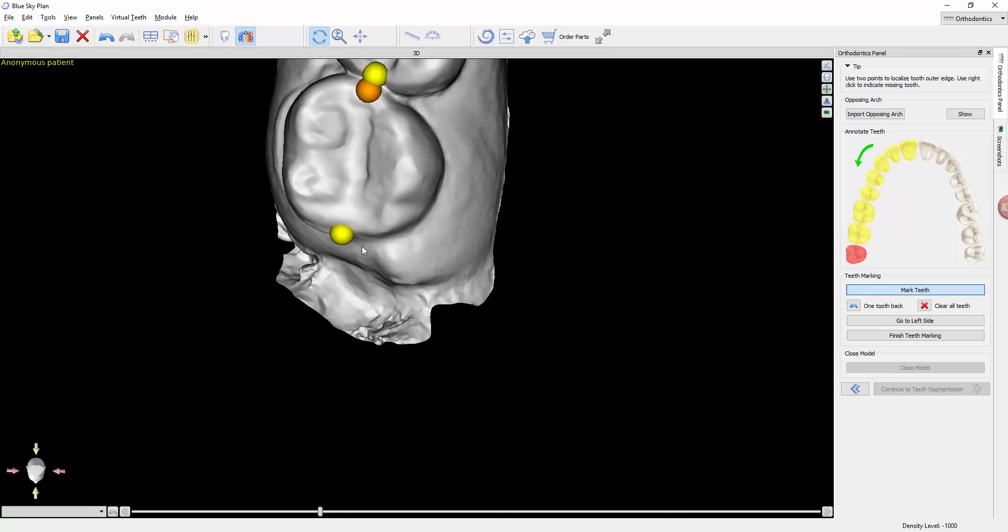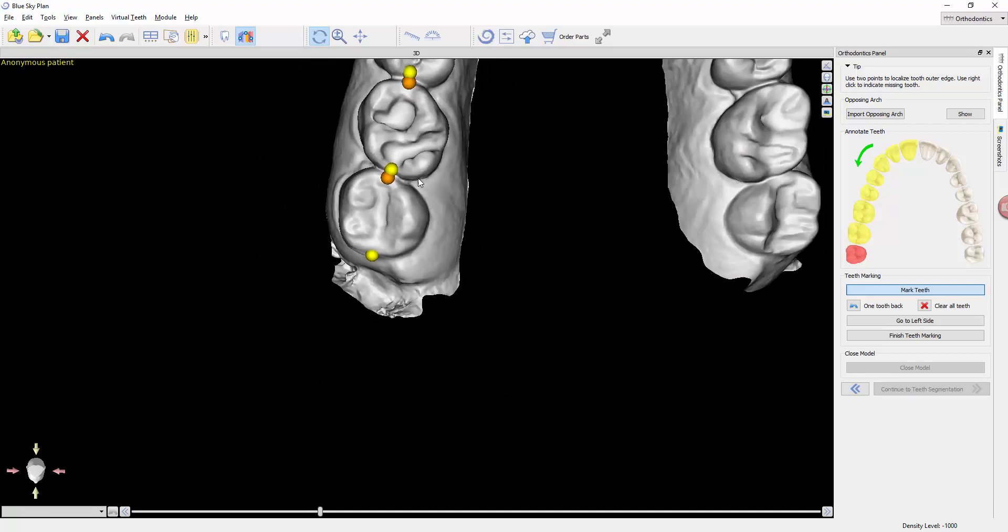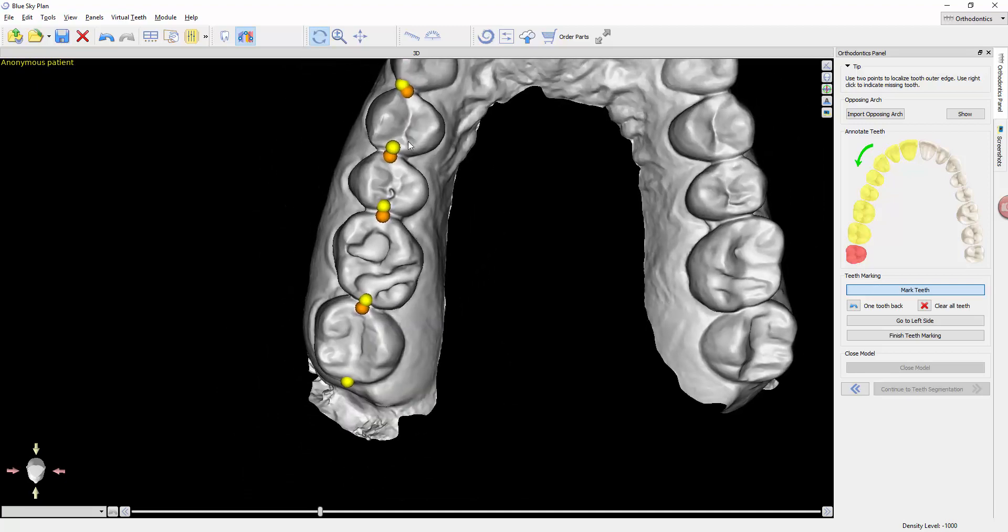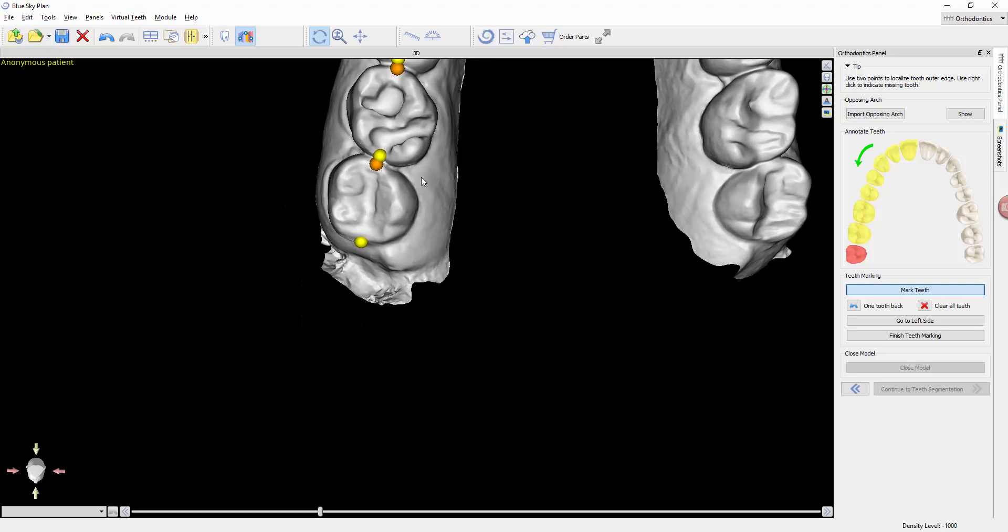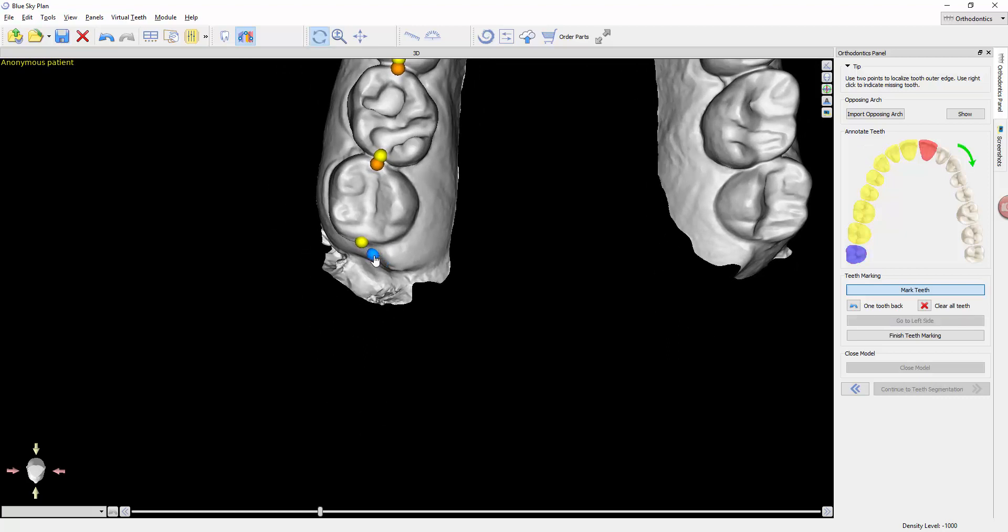We don't need to note the wisdom tooth, but if you were missing a premolar, you would do this as well. Instead of left clicking, you would simply right click, it makes a blue dot.